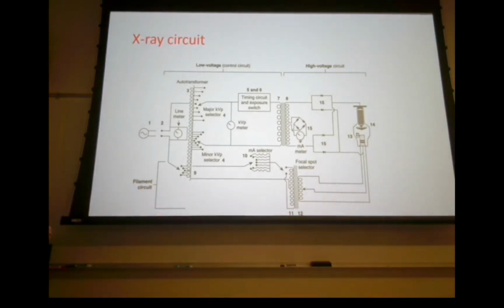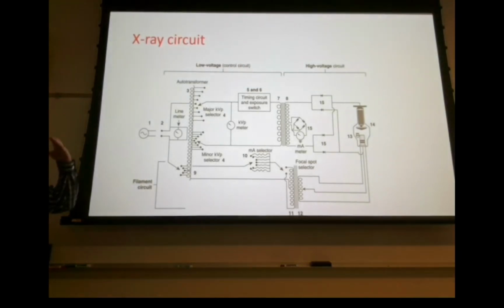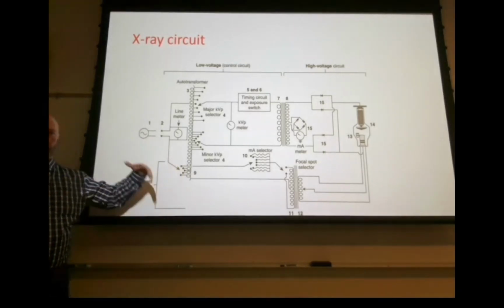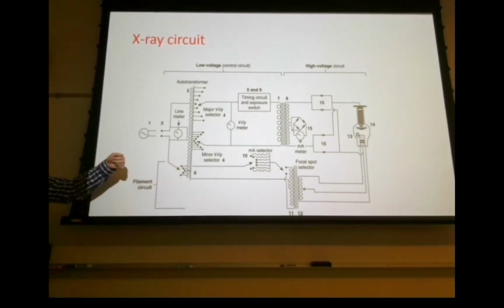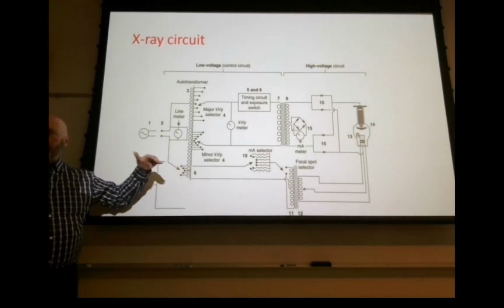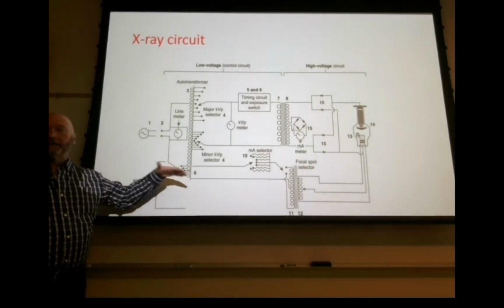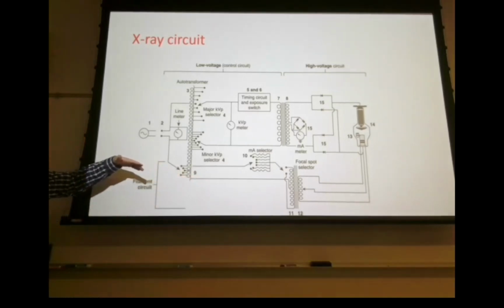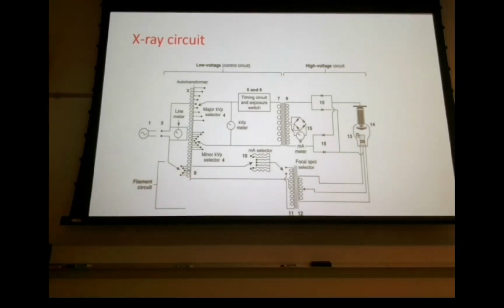And at the same time, if at the moment you make your exposure, the air conditioning kicked on, and you get that sucking of the power from all over the hospital and the lights dim, you make your exposure, then you're going to get 5 less kVp than what you need, right? So the purpose for this is to keep that at a constant input of voltage, so we know what we're adjusting, right?